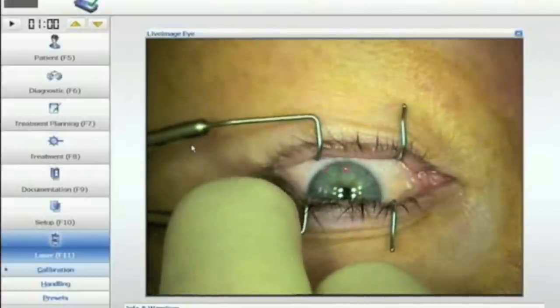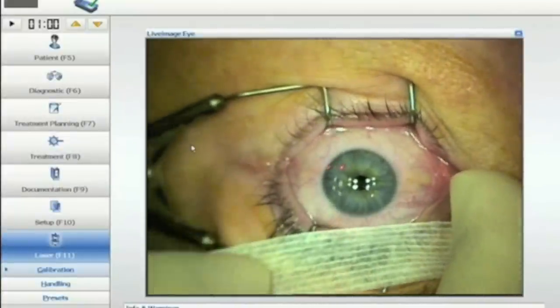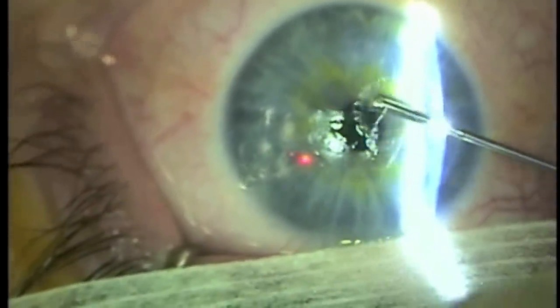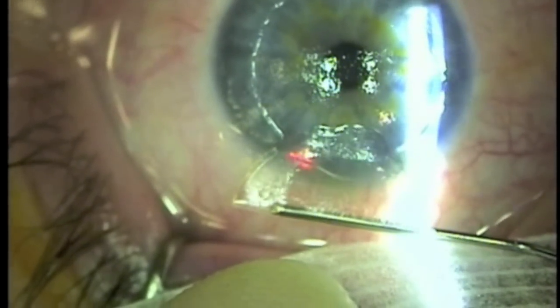This video covers the use of tissue glue in cases of stubborn epithelial cell in-growth. The eye is prepared using a speculum and tape for the lashes. A flap lift is performed using your instrument of choice. As the flap is dissected free and reflected back on itself like a taco, the sheet of epithelial cells is visible on the corneal bed.